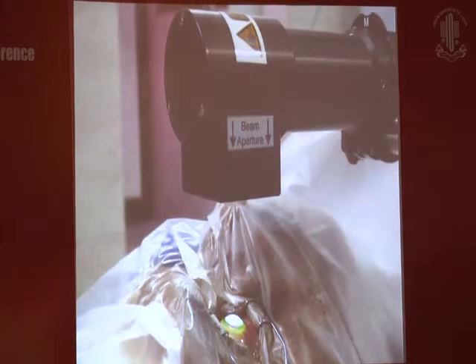It is therefore important to pay attention to the draping of the lid margins with your plastic drapes, and then the standard protocol that we've been following all along, which also is called the Dresden protocol, we use riboflavin 0.1% with dextran. We apply it every 2 minutes for a period of 20 minutes, and then irradiate the eye with ultraviolet for a further period of 30 minutes, during which we again apply the riboflavin about 10 times once every 3 minutes. Topical anesthetics and antibiotics are used as required.